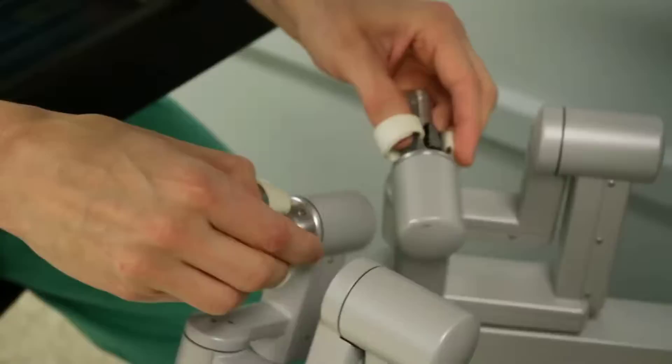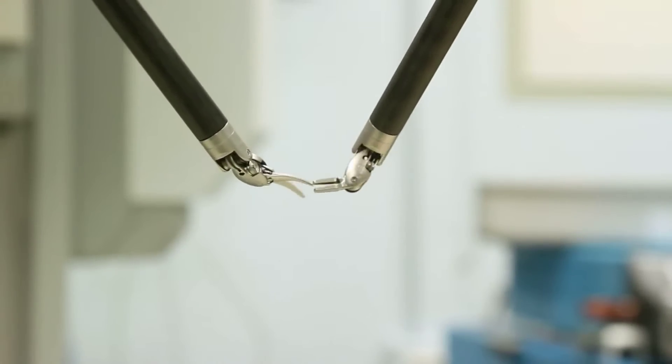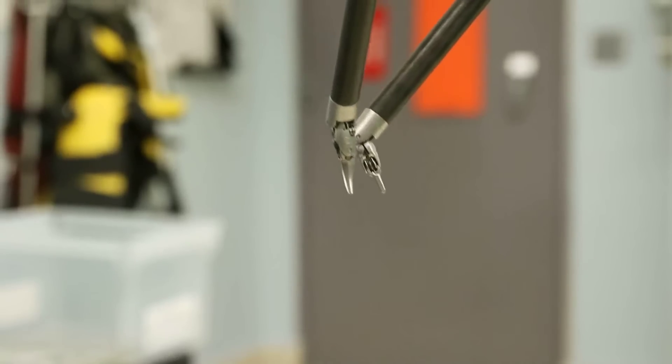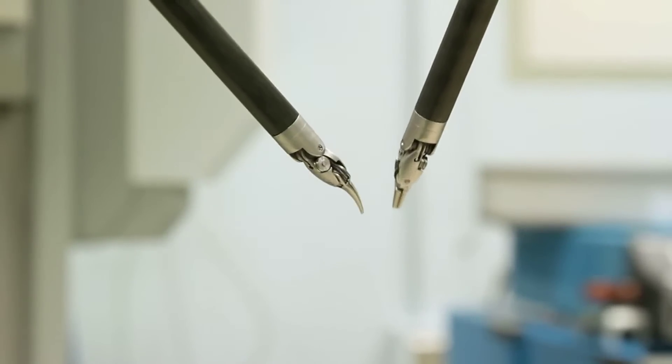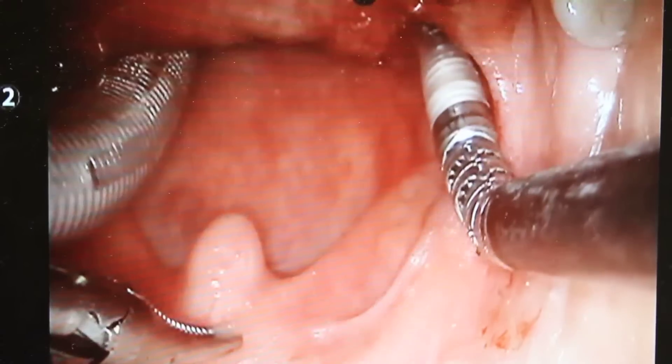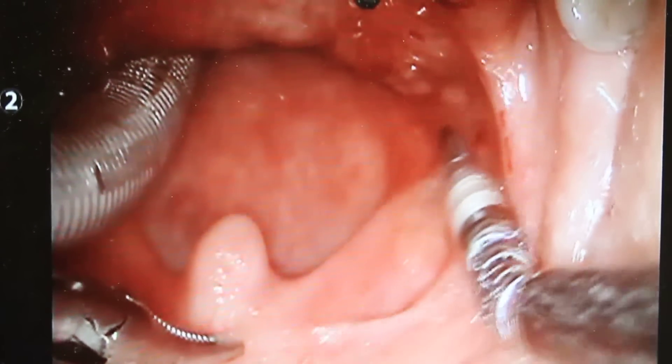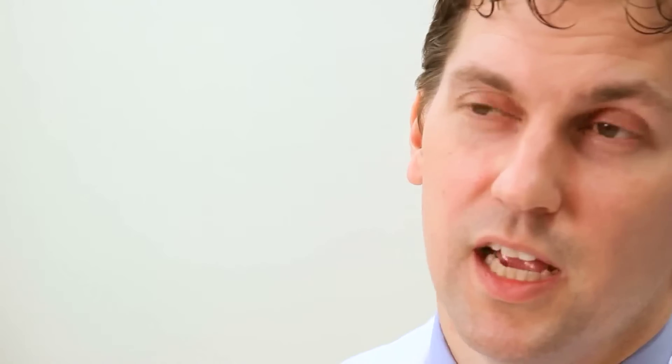When the camera is placed an inch and a half or two inches away from the tumor, the visualization and magnification that's provided are superb. You can really delineate the line between where tumor begins and normal tissue ends very clearly, and this allows for very safe and precise removal of the tumor in tight quarters of the mouth and throat that we weren't able to remove tumors from previously.